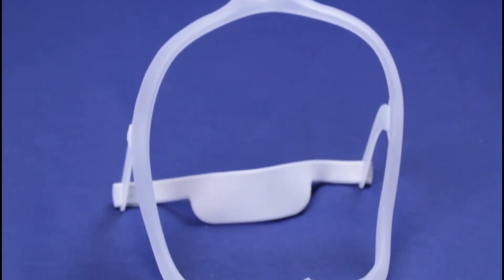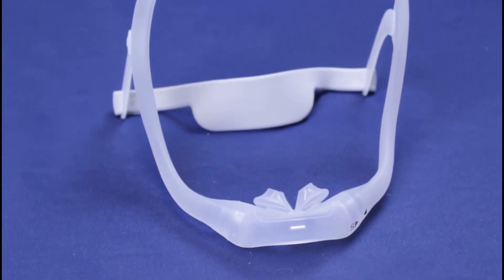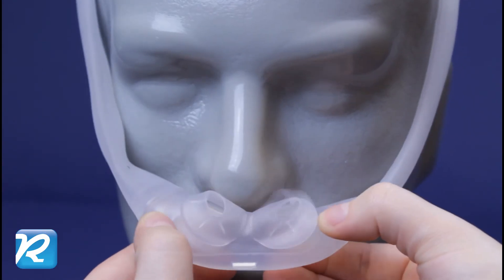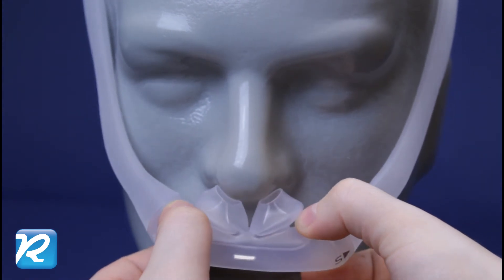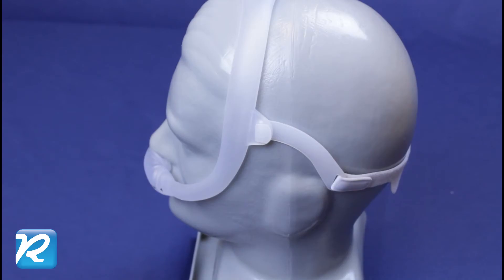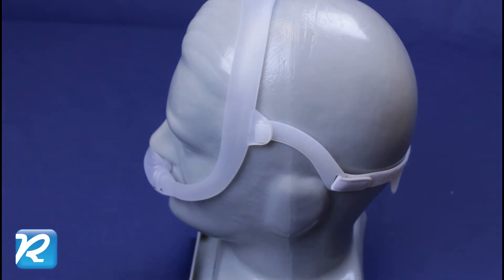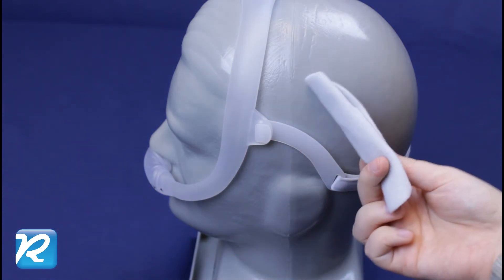The all silicone nasal pillow cushion connects between the two sides of the frame. The tips of the pillows rest just inside the nostrils and the base sits below the nostrils. The headgear has eyeglasses-like arms that rest over the ears. Fabric wraps are included and can be placed on the sides of the frame.